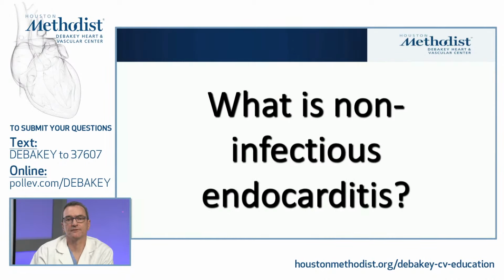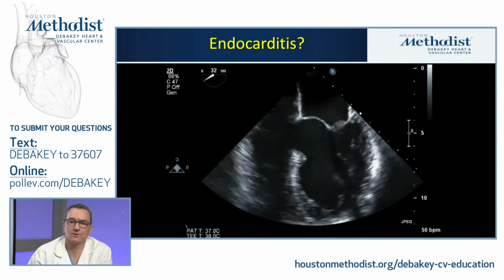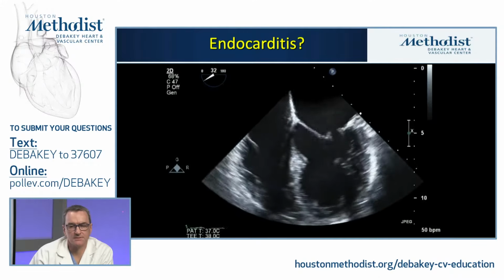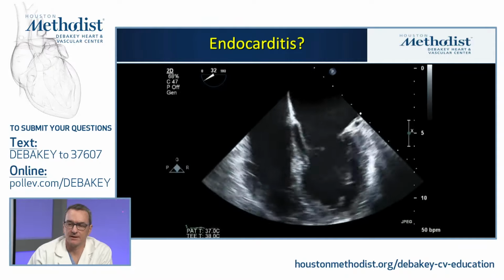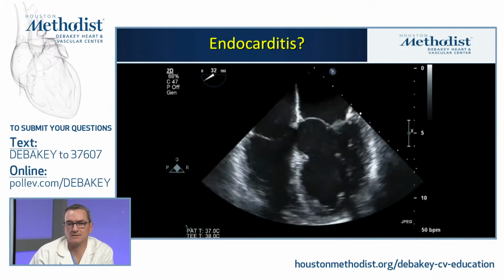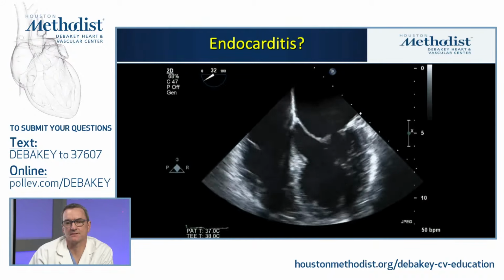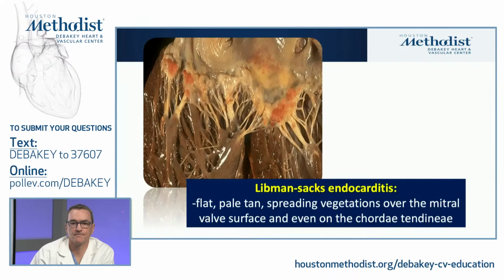So to touch briefly on the notion of non-infectious endocarditis, in this 4-chamber echo, if you look closely again at the mitral valve, you see some very small, friable material, looks almost like carpeting on the very tips of the valve. So quite unique in terms of what we would generally identify. It would almost be considered a Lambl's excrescence if it were on the aortic valve, but it's on the mitral valve. So this is an example of Libman-Sacks endocarditis.